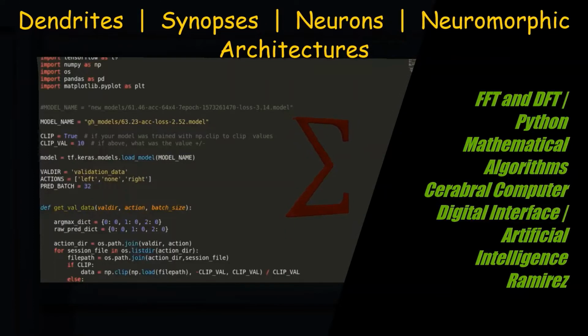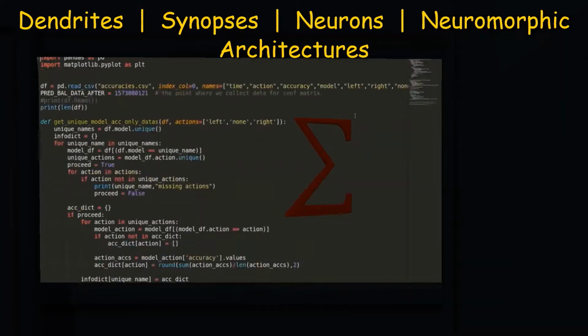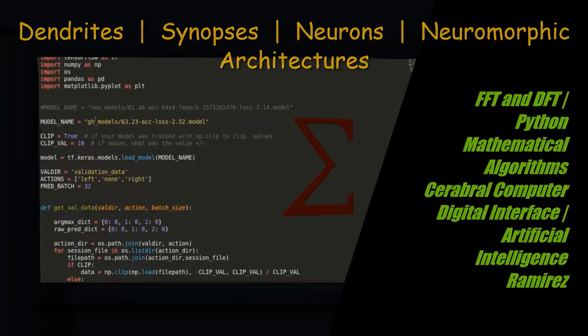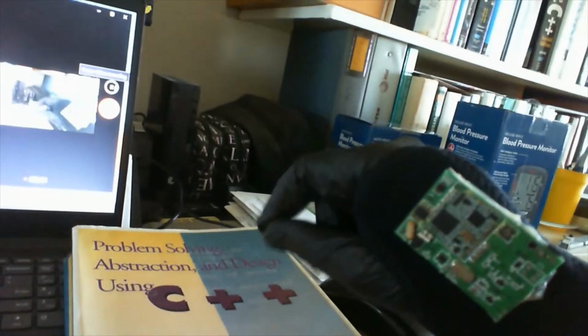The BCI would exploit the spatial information by extracting features from the EEG channels localized over the motor areas within the cerebral cortex: channel C3 for right movements, Cz for foot movements, and C4 for left hand movements.